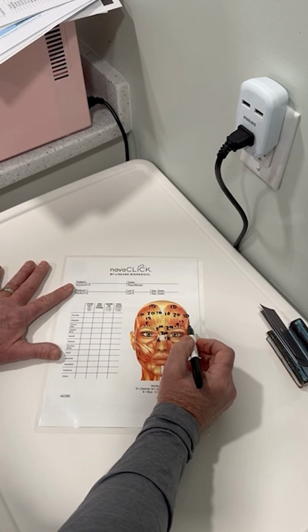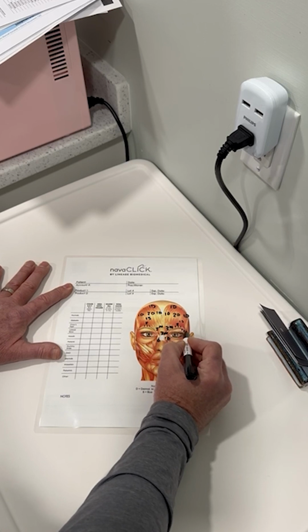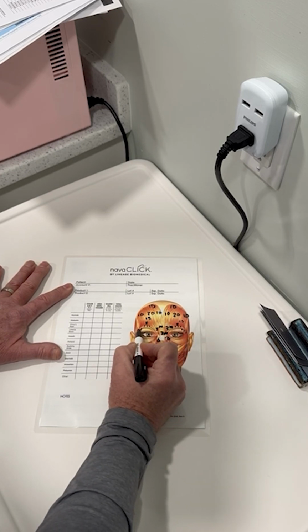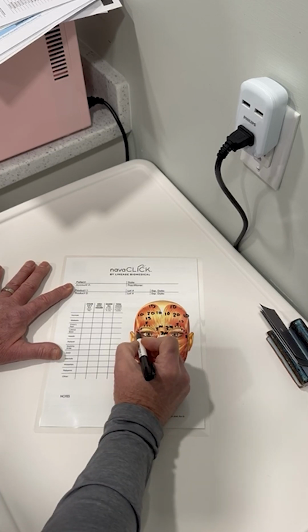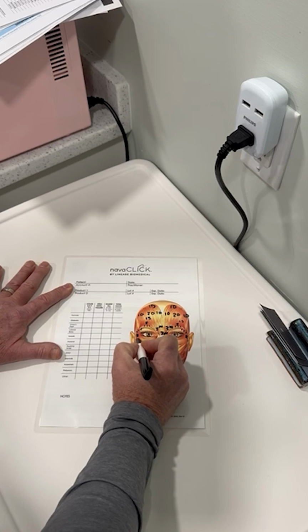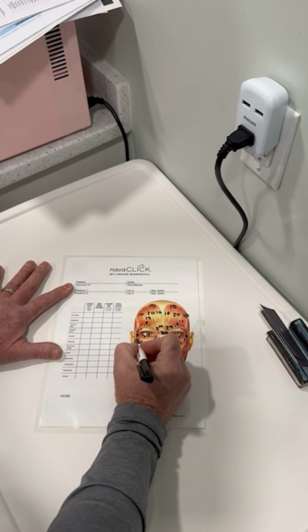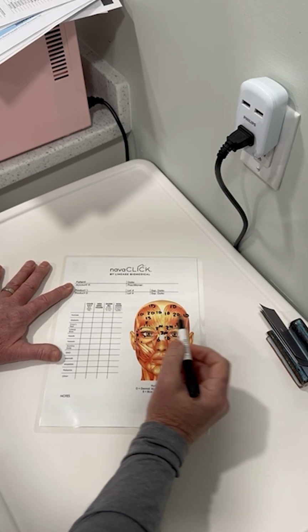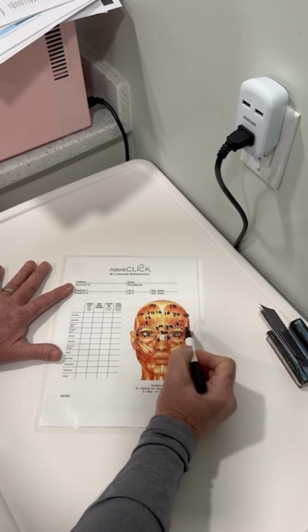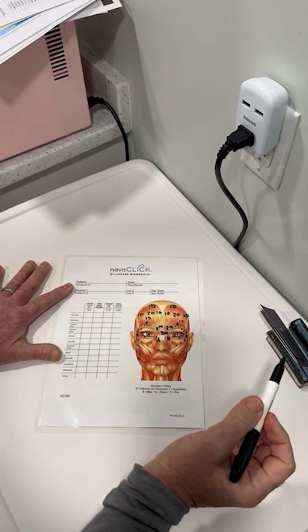Now you saw my photos, and I have a lot of depressor muscles, so I'm actually going to do 1, 2, 3 in each of my higher depressors. Okay, then I'm going to do 2 units in the heavy crow's feet here, and then I'm going to go 1, 2, 1 in the jelly roll, 1, 2, 1 in the jelly roll, and then I'm going to actually do a superficial out here to where I have those extended crow's feet that extend. Now these are all dermal. This is a superficial, and I will chart that in the computer that way, which I'll show you in a few minutes. Now, I haven't added any of this up.